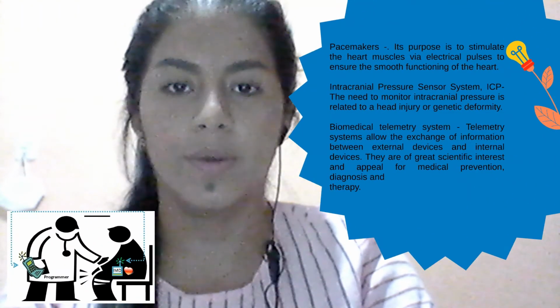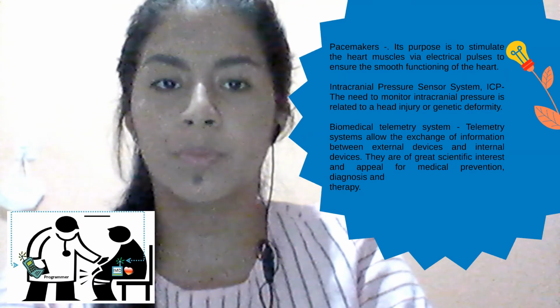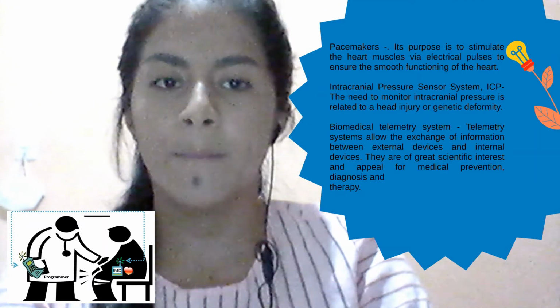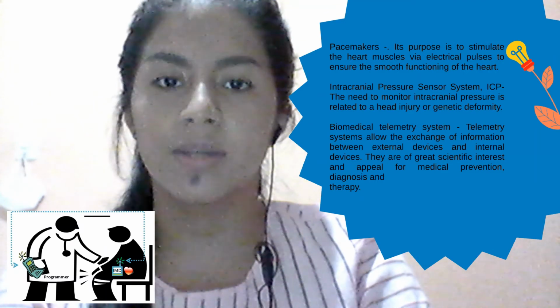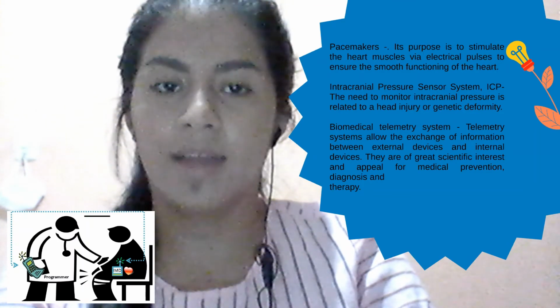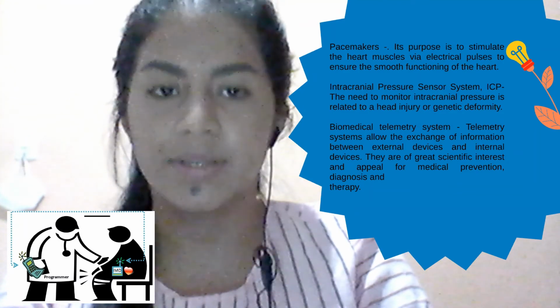Applications in Ecuador. 1. Pacemakers. Its purpose is to stimulate the heart muscle via electrical pulses to ensure the smooth functionality of the heart. 2. Intracranial pressure sensor system.